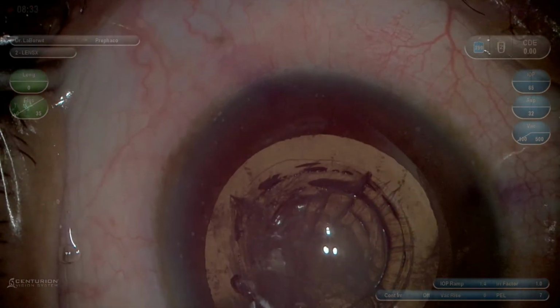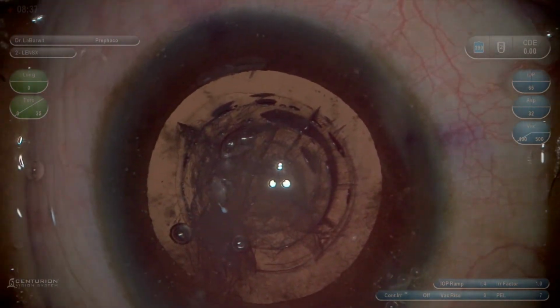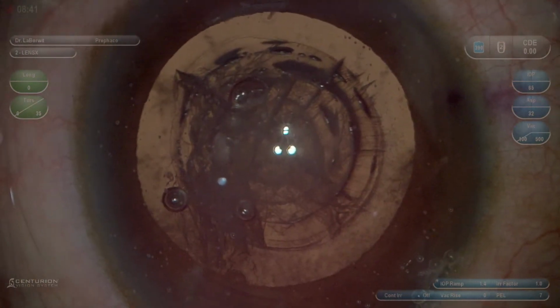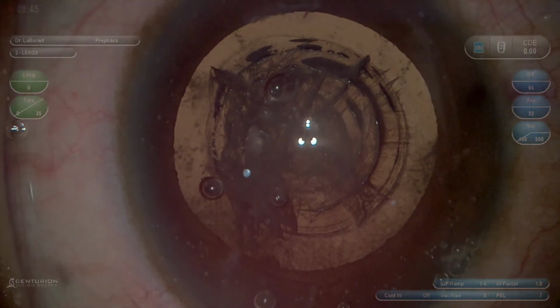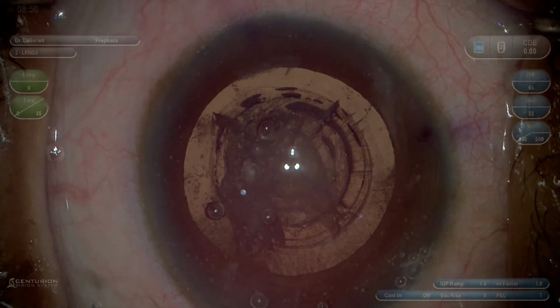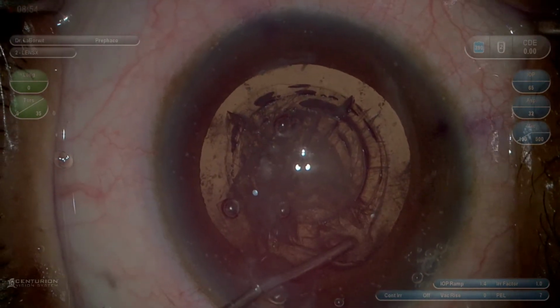And you might see, if you look closely, that I may have not gone outside to connect to the final piece. So I kind of zoom in, but I'm not going to go back and mess with it at this point, but I'm going to tiptoe in this area at 11 o'clock. But I'm not certain I went outside the intended capsulotomy to reconnect as I went clockwise.